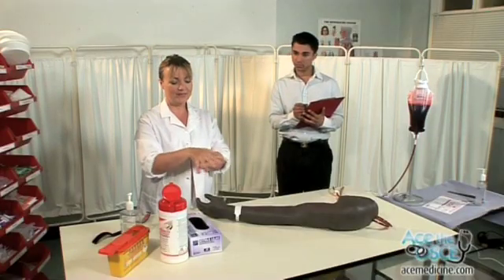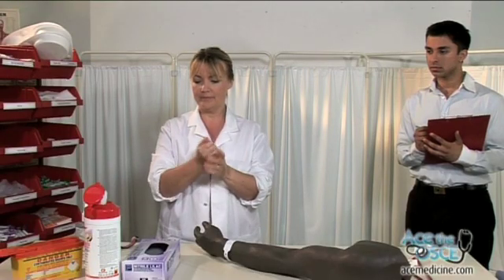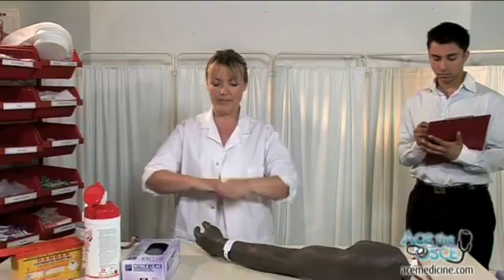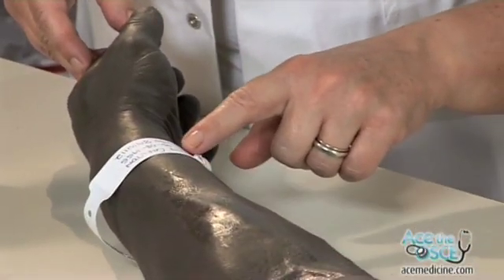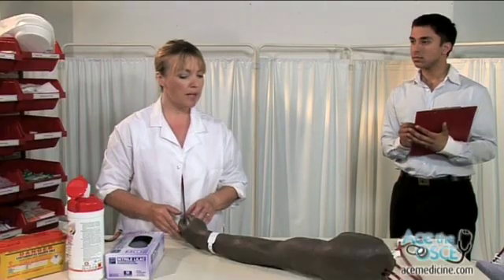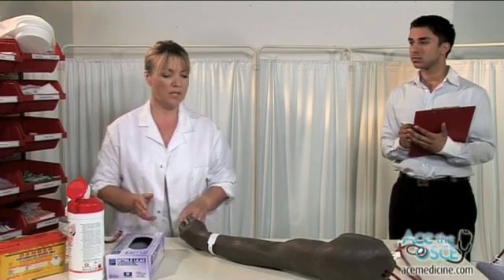Wash your hands using the seven-stage technique. Hello sir, my name is Deidre Wallace, one of the medical students. Can I check your name? I need to take blood from you today. Is that okay? Have you had this done before? Good, I'll just get some equipment.